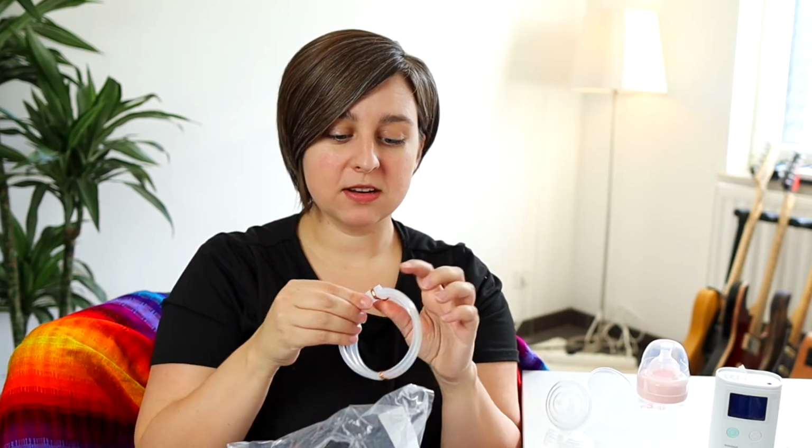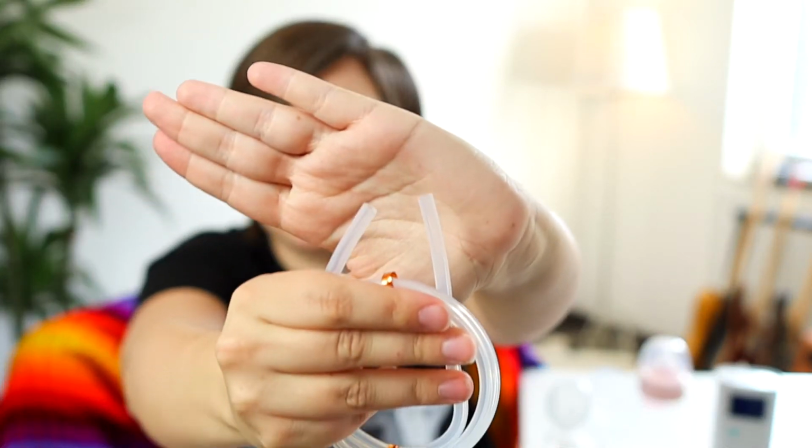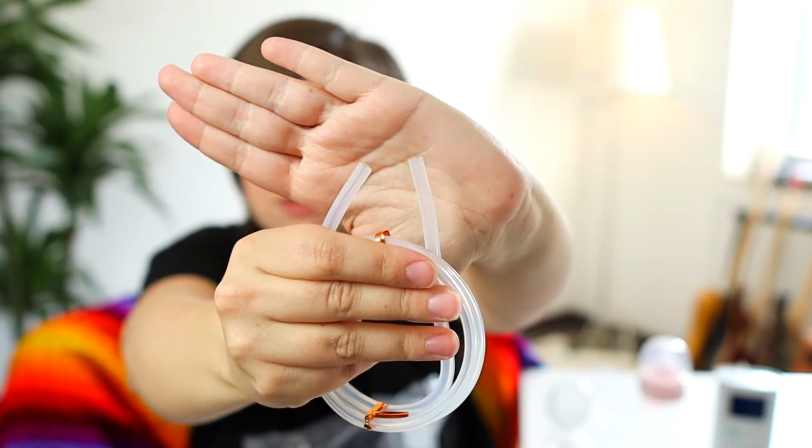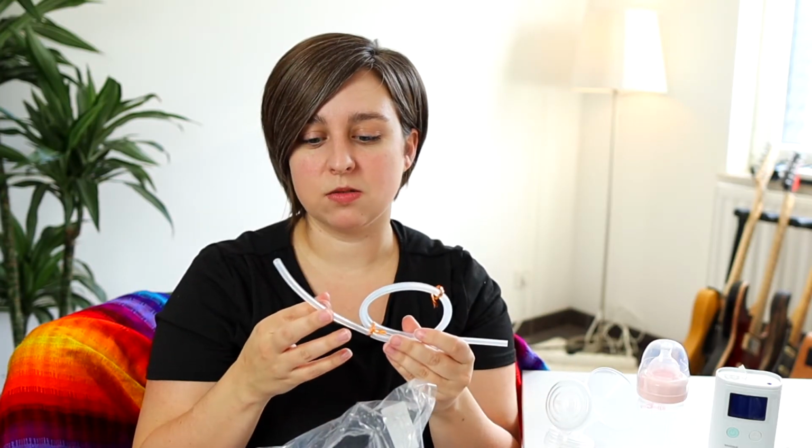Also, your tubing. Both of the ends of this tubing are exactly the same as well. So again, you can't screw it up. You can also cut this tubing if it's too long once you get used to using it. If you're using it in a particular way and you find that this tubing is too long, you're welcome to cut that because it's just a flat tube, nothing special.